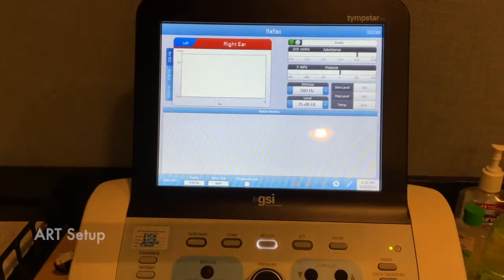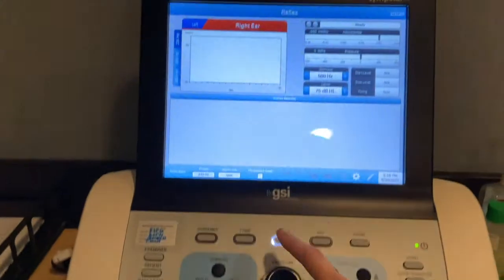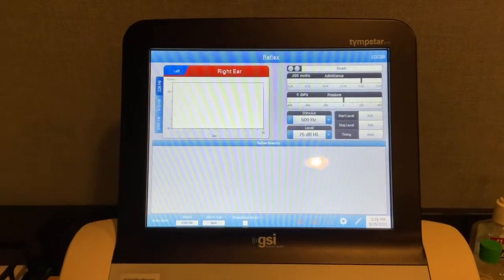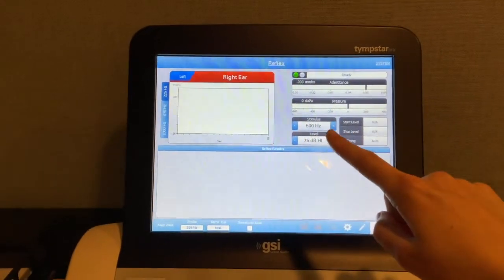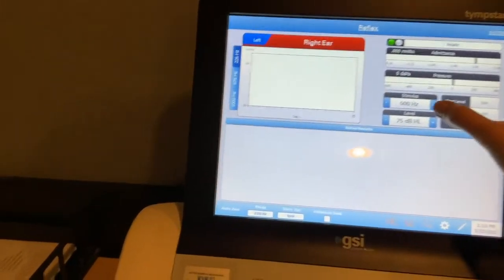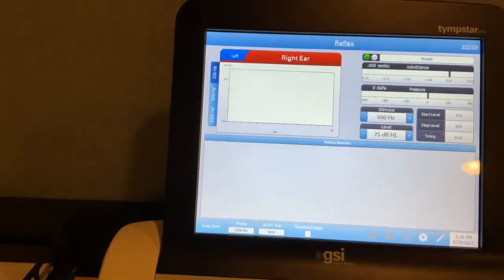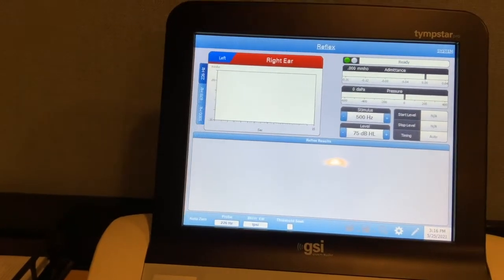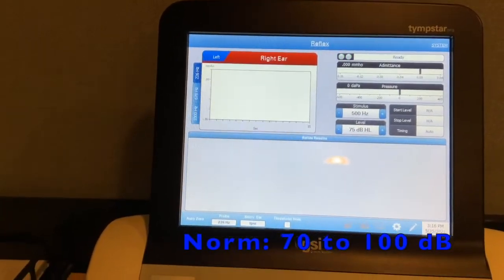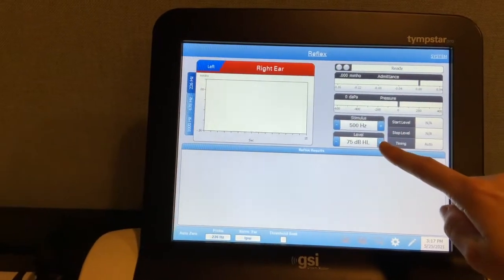All right, so for reflexes, you're going to want to make sure that the reflex button is pressed, and here's what the screen will look like. You will want to do it at 500 and 1000 hertz, and you can just change it like this, or change it back, whatever you please. The normal reflex range is between 70 to 100 dB, which is right here, and we will show you how it works. We're going to use it on Maggie.